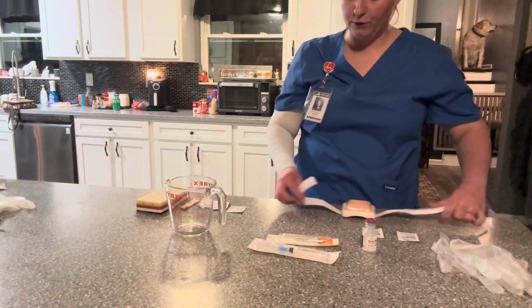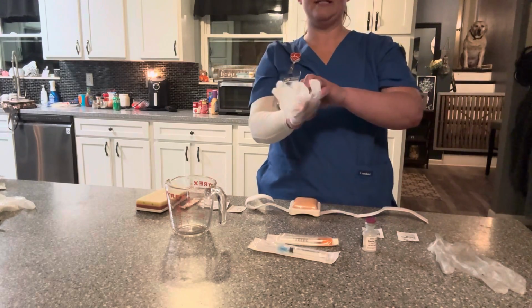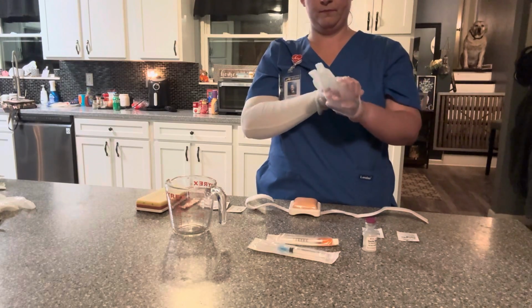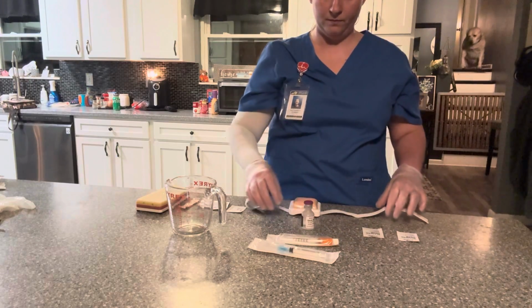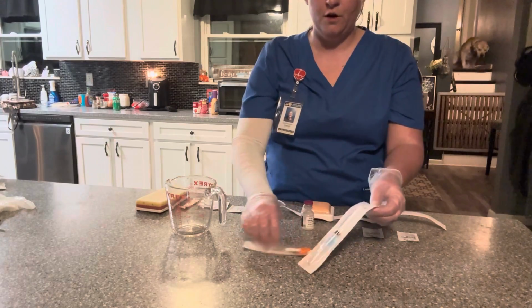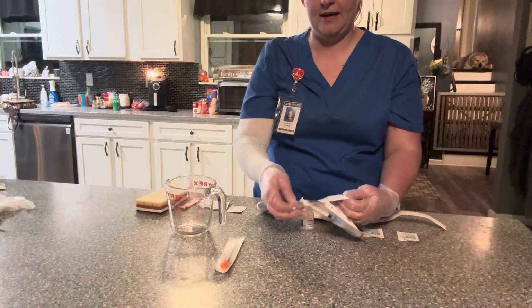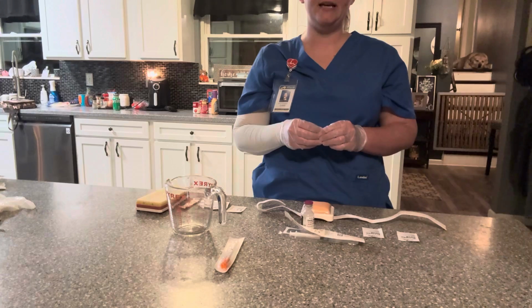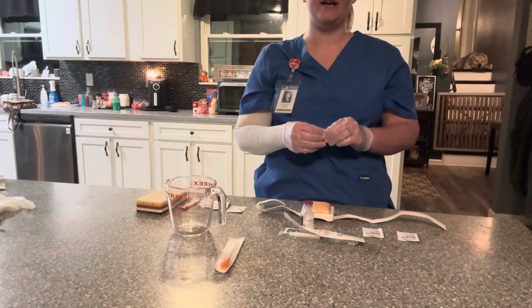To give a proper deltoid injection, I would sanitize my hands, don my gloves. For this injection, it is usually given with a 20 to 25 gauge syringe and a 5/8 to 1.5 inch needle.